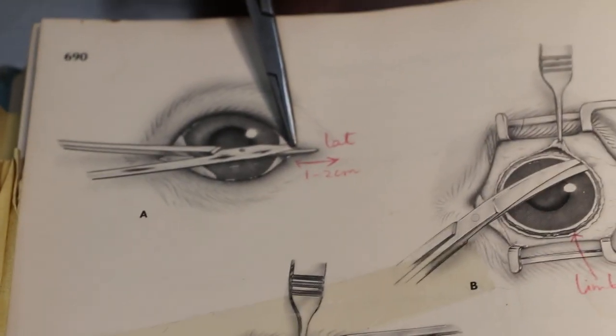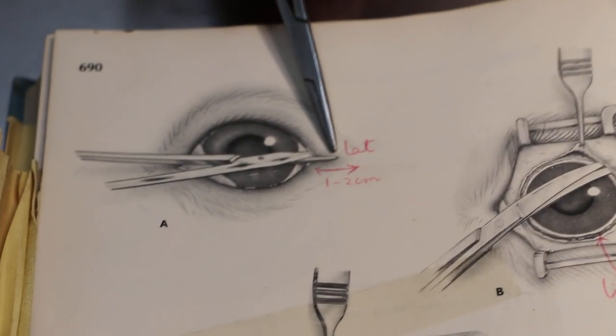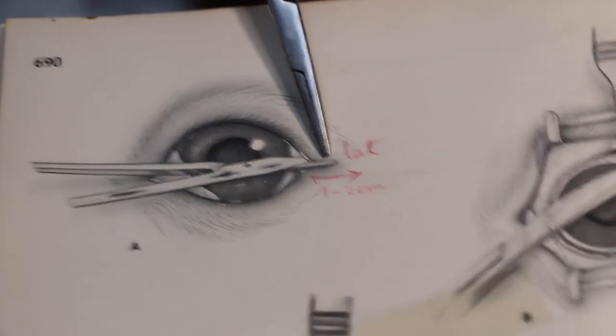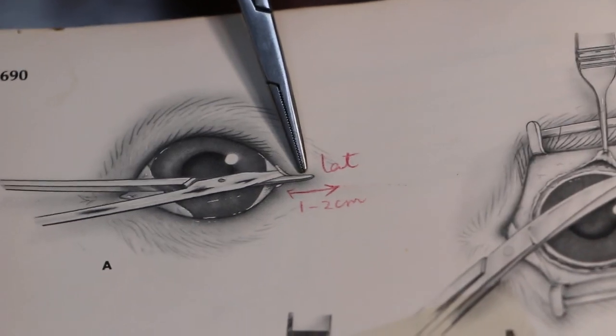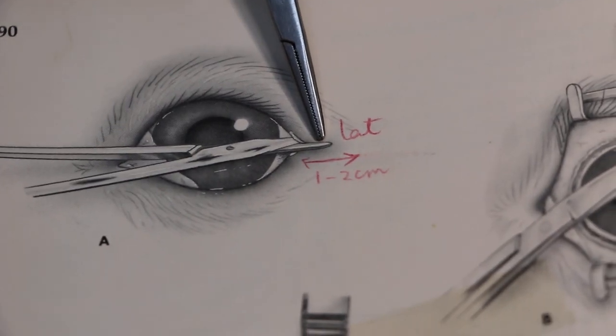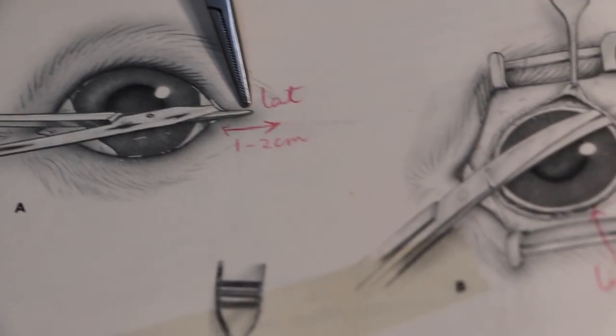The first part: under general anesthetic, I cut the lateral canthotomy about two centimeters. There was bleeding, so I clamped the bleeder so that there's no blood all over the place — clamp it.